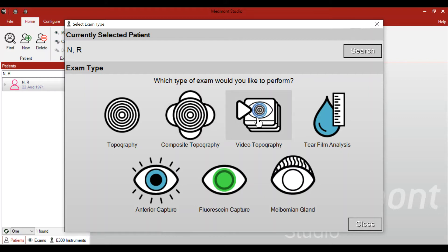The next test is video topography, which allows you to observe the placido reflection off the tear film through a succession of images seen in video. Multiple images are taken, and the user can decide how many frames per second and how many seconds the test runs, allowing you to observe the tear film in real time.